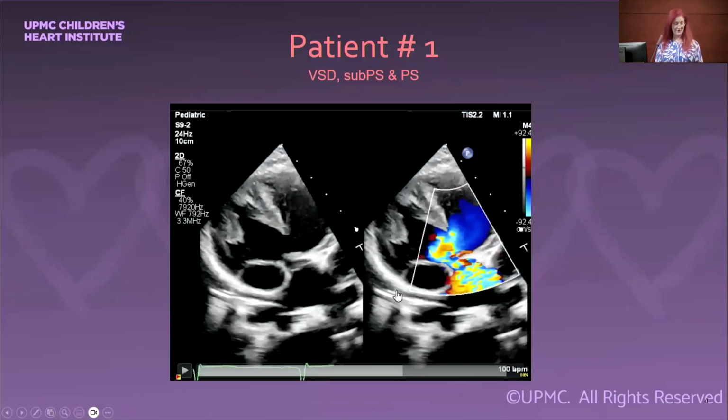For the fellows out there, there's an advantage to being a fellow. This is a great picture, and if we'd stuck to the standard views, we never would have got it.